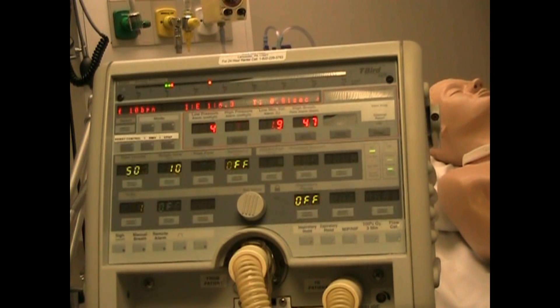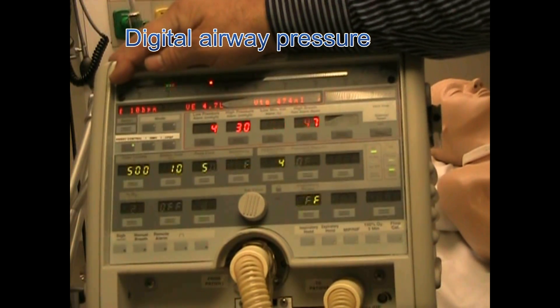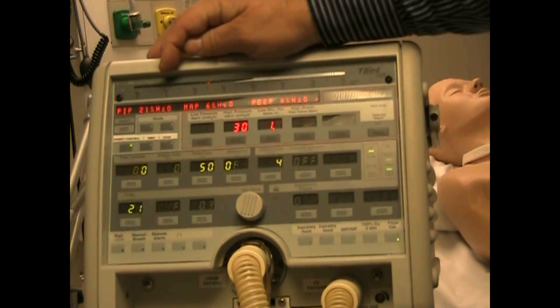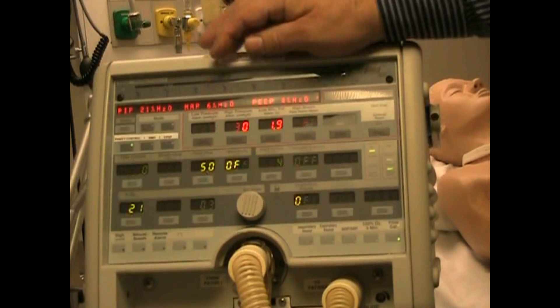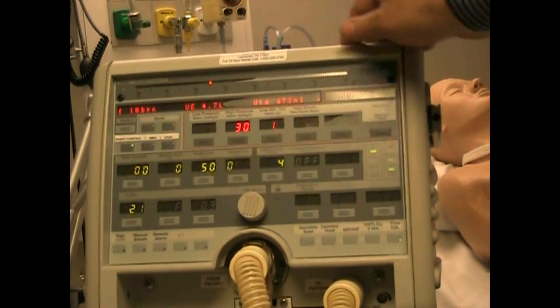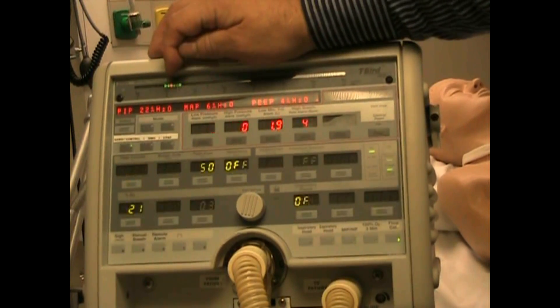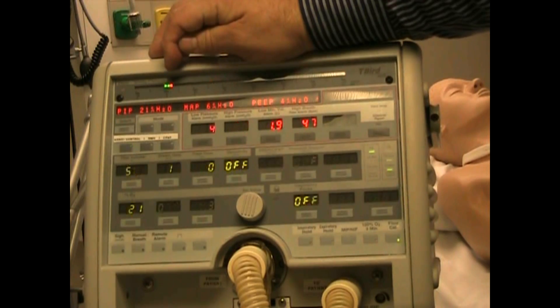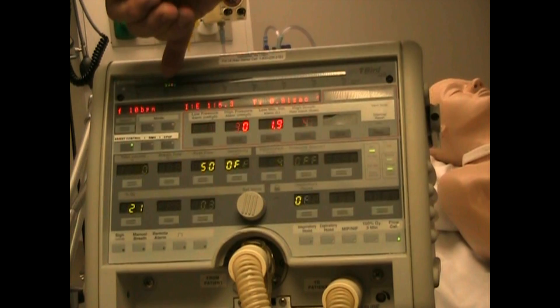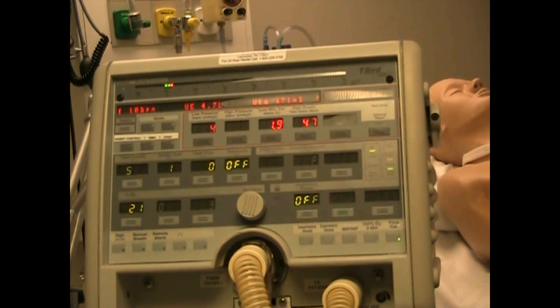Let's take a look at this top here. This is our digital airway pressure manometer and you can see that it rises with each breath. This orange dot is your high pressure limit. Down here you see your settings for PEEP. PEEP is four and we see two boxes and also the indicator light.